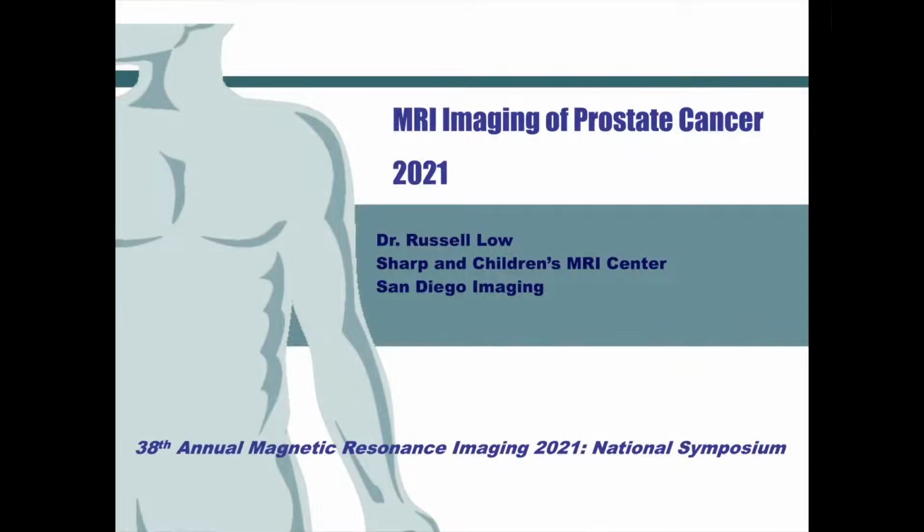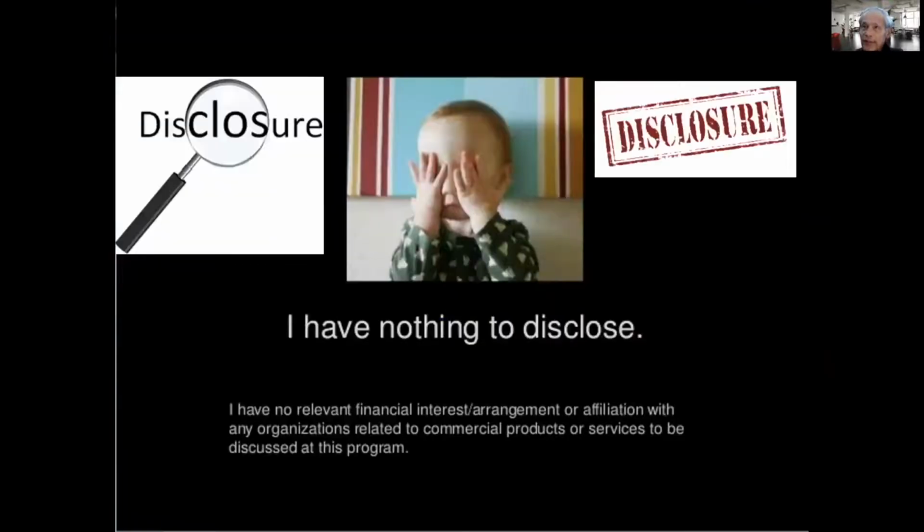Good afternoon. In this next lecture, I'd like to talk to you about a very important topic, and that's the use of MR imaging to evaluate prostate cancer.